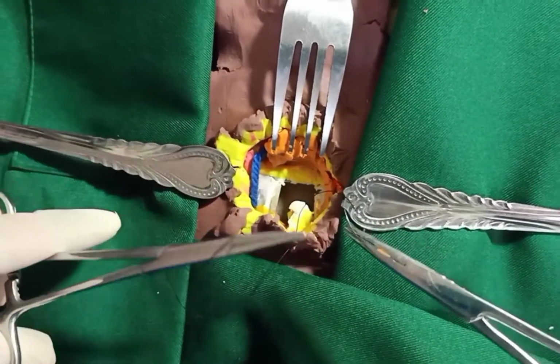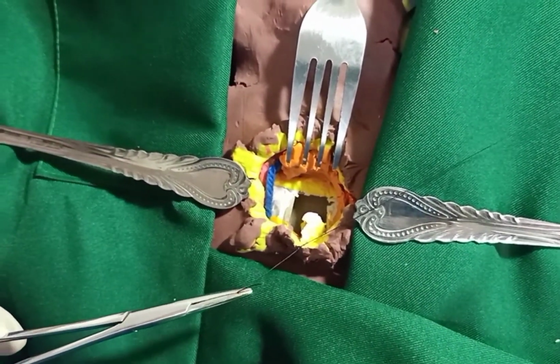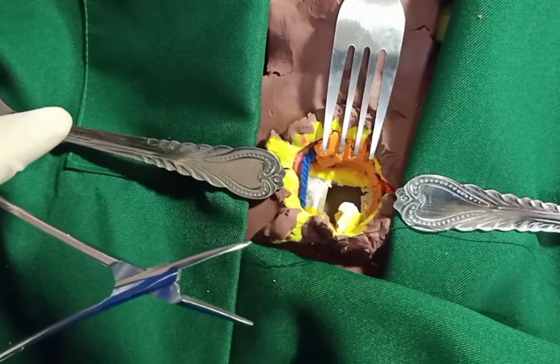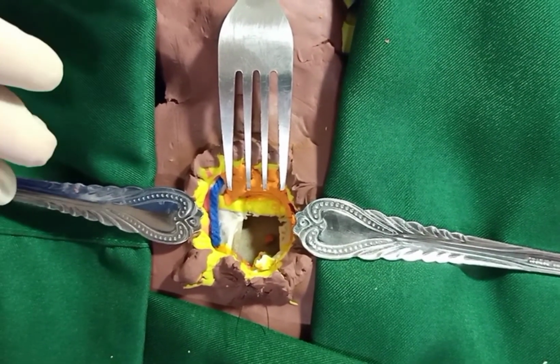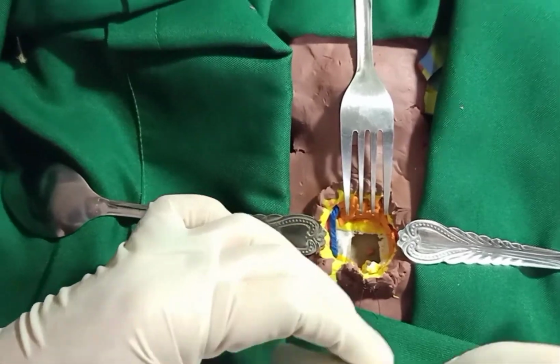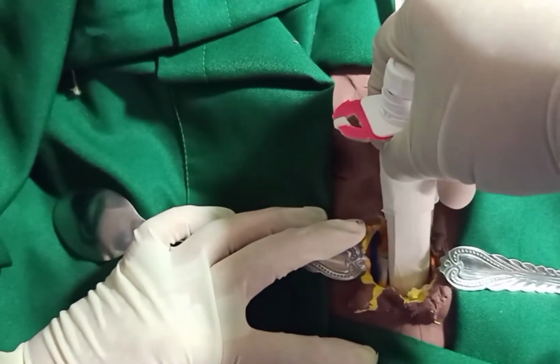Now a silk traction suture is passed through this anterior tracheal flap and loosely secured to the skin. The traction on the suture facilitates reinsertion of the tracheostomy tube in case of accidental decannulation. Now communicate with the anesthesiologist to deflate the cuff of the endotracheal tube and gently pull it back until the tip is just above the opening. Now I will gently advance an appropriately sized tracheostomy tube through the opening in the airway.